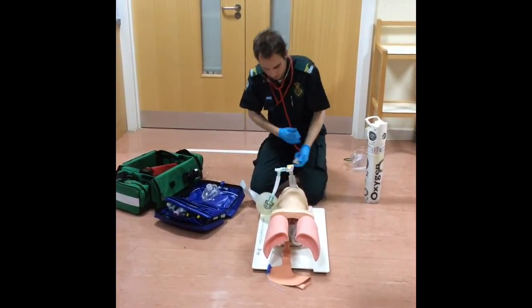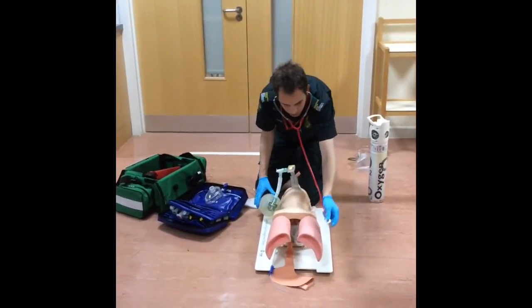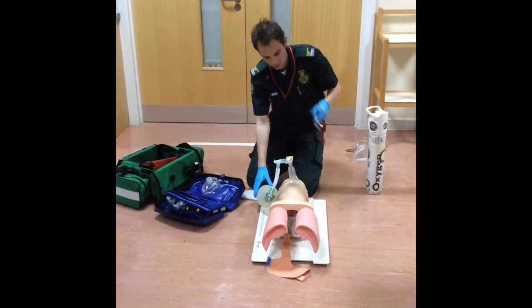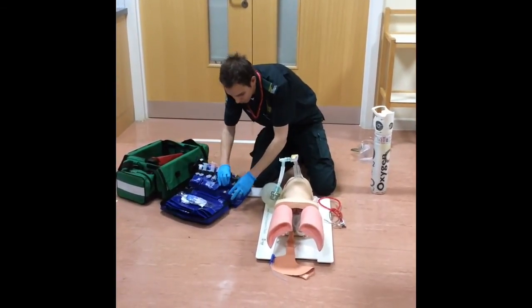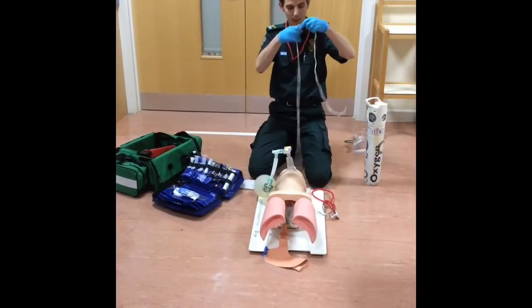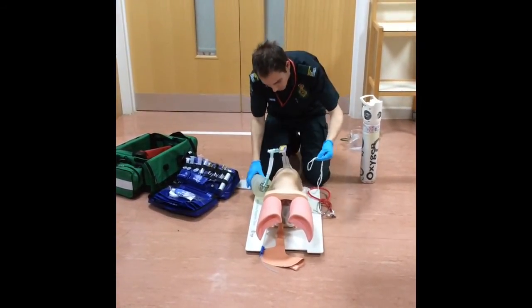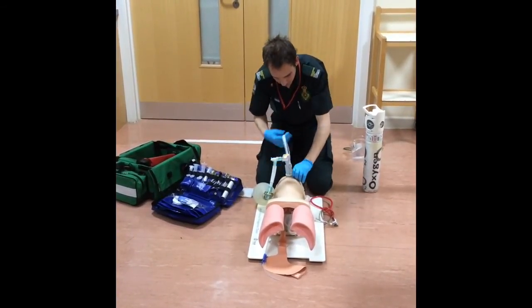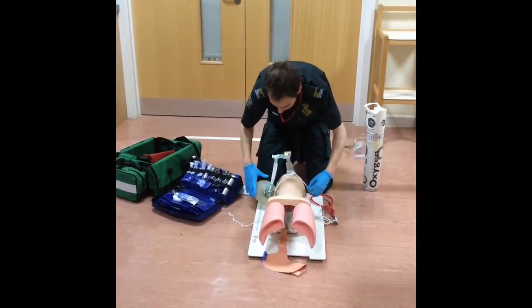I'm just going to check my placement. Good air entry, good air entry, good air entry, good air entry. So I'm happy I'm in the right place. I'm now going to continue to ventilate the patient around every 6 seconds, but keeping an eye on the easy cap to see whether I'm getting the right colour come back, or the right figure if I'm using a different device. I may put the patient on a pulse oximeter as well, so that I can keep an eye on that. And then just tying the tube in.